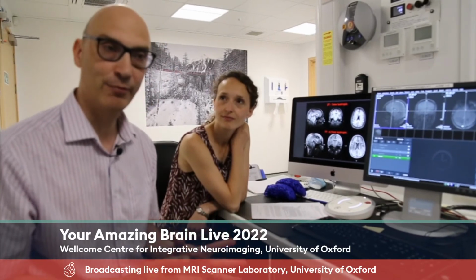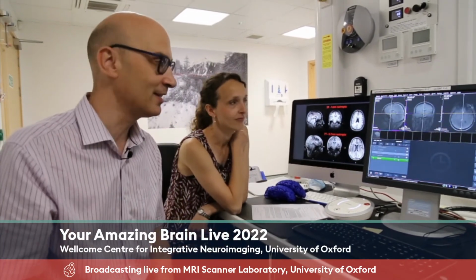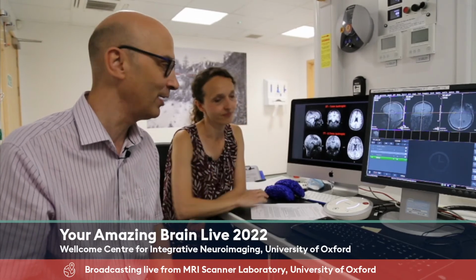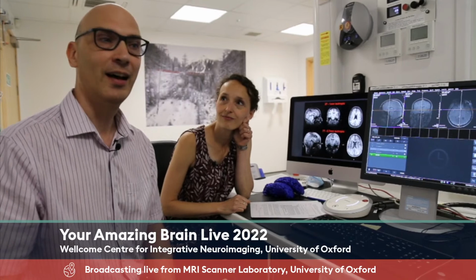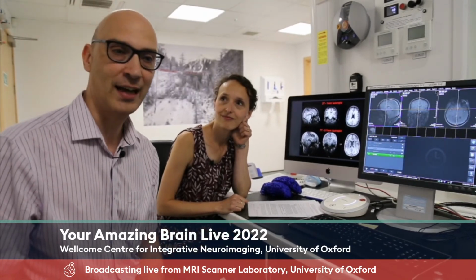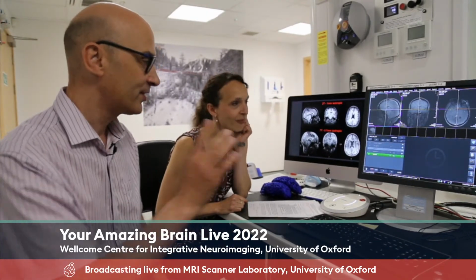But what we've done is we've given Barbara some earplugs that go in her ears to make it much more comfortable for her. So it's not too bad. And we've both been in scanners before, and it's not too uncomfortable. We'll try and make people feel as relaxed and comfortable as they possibly can. So we'll let this run.